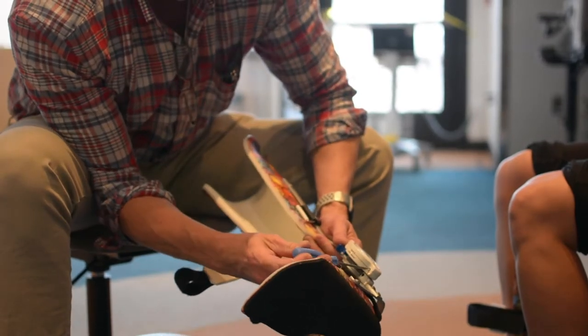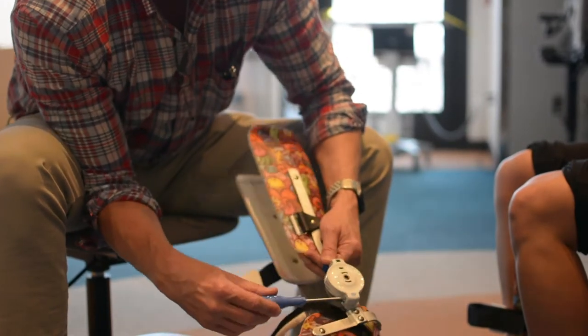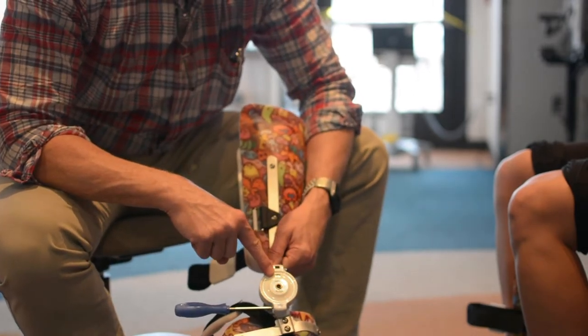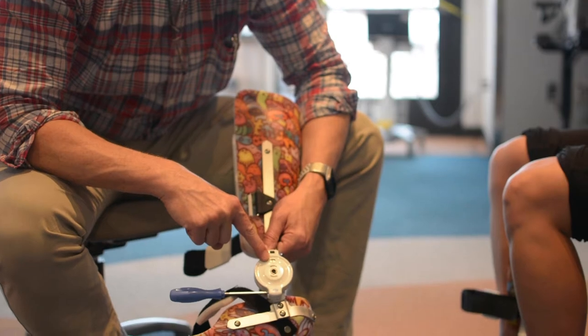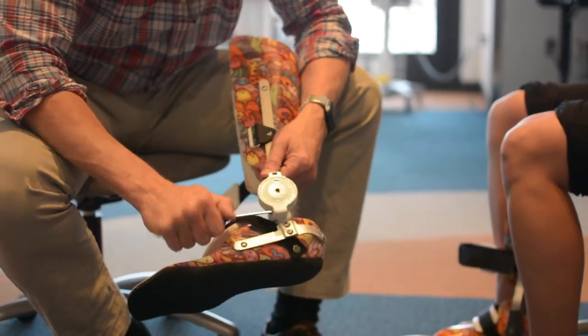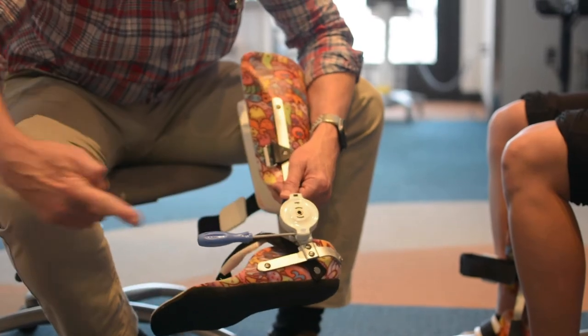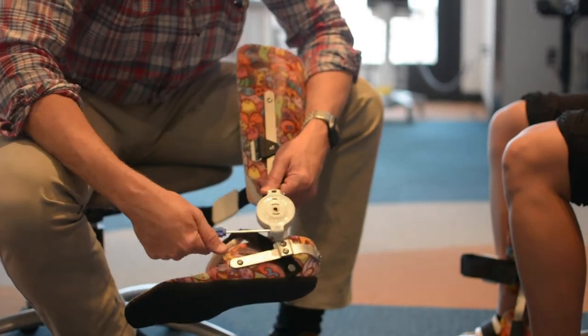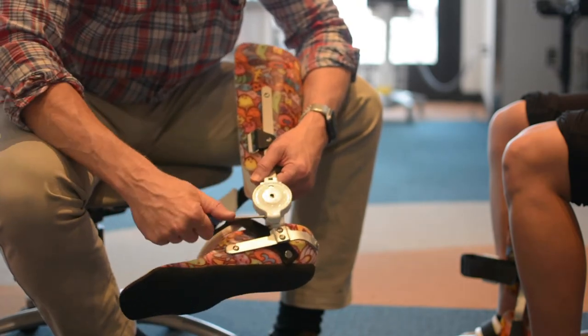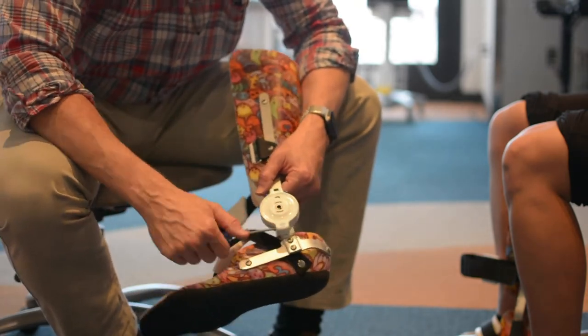There's just a little hole here and it takes an Allen wrench. When you put that in, the tension value number is right here — right now that's on three. As I turn the driver, what I'm doing is taking this big long piece that's been coiled and just tightening that coil inside of the housing, so it wants to be straight. It just makes it a stronger push.